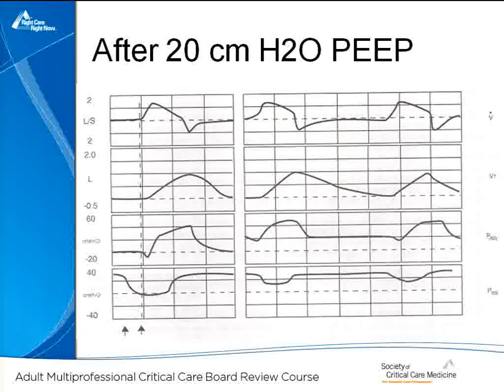Okay? And what does that do? If the pressures are now closer to each other, now the patient's effort has to be much less to change the circuit pressure. So the correct answer here is to add PEEP, but the correct answer is to add 20 of PEEP because this poor individual has got almost 35 of PEEP trapped inside her lung.